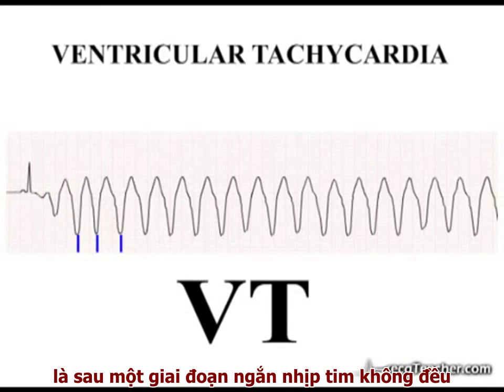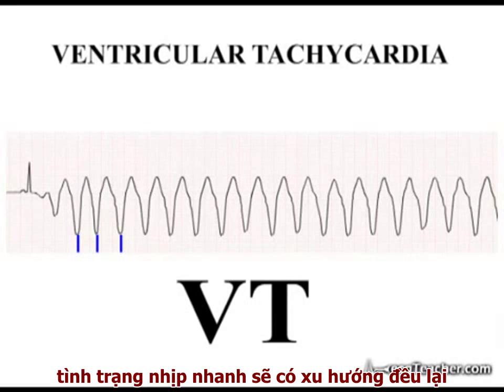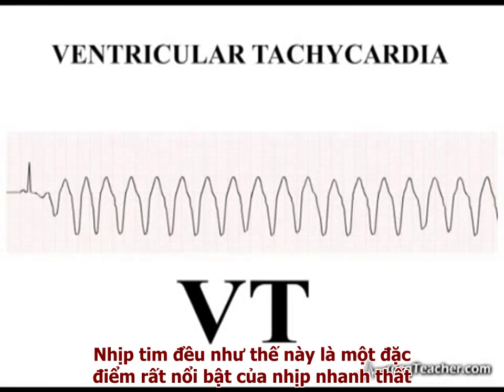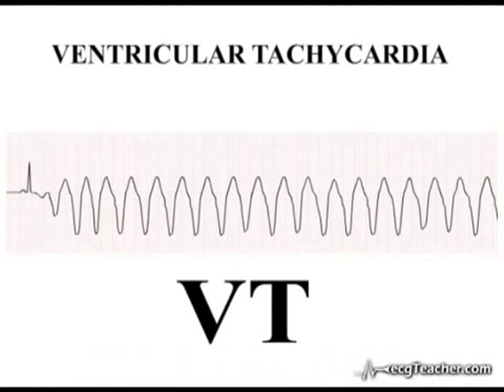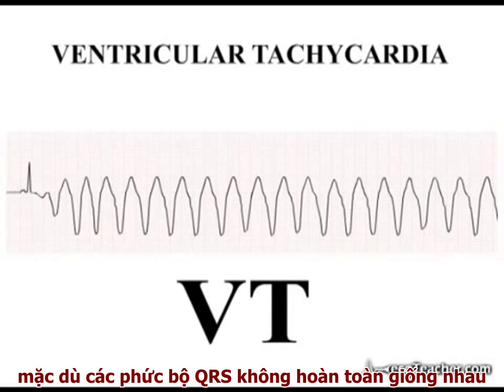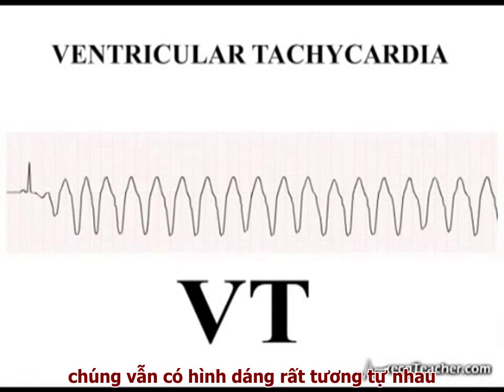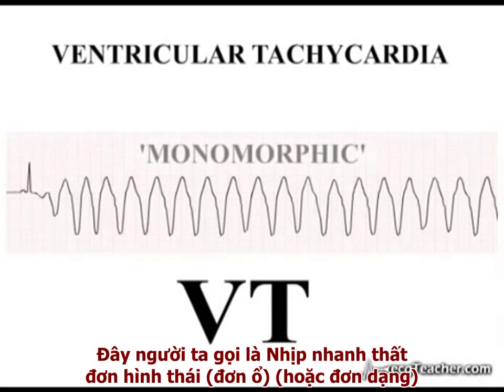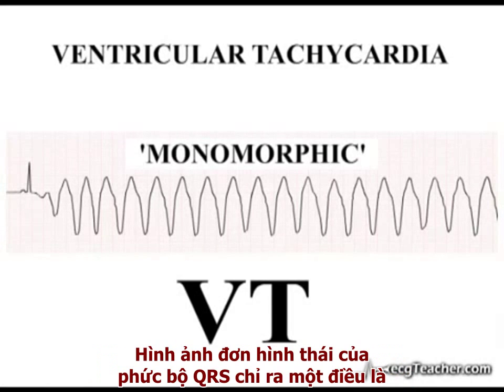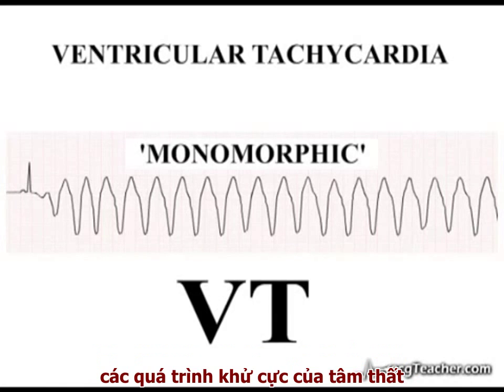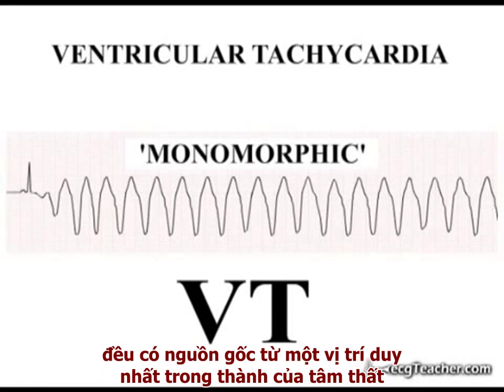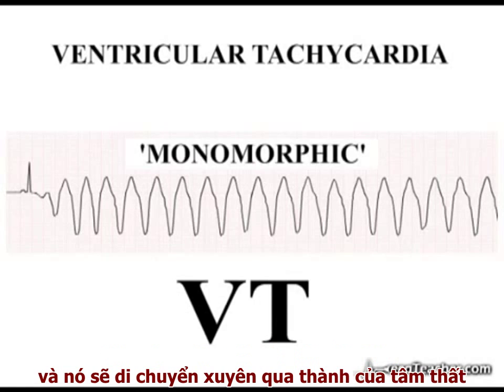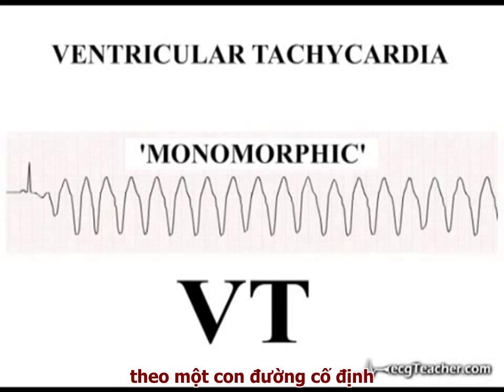You will also appreciate that following an initial brief period of irregularity, the tachyarrhythmia is monotonously regular. This regularity is a very characteristic feature of ventricular tachycardia. In our patient's case, although not completely identical, the QRS complexes are very similar in morphology — this is a monomorphic ventricular tachycardia. The monomorphic morphology of the QRS complexes indicates that each episode of ventricular depolarization is originating from one single site within the chambers and is moving through the ventricular myocardium in a constant pattern.